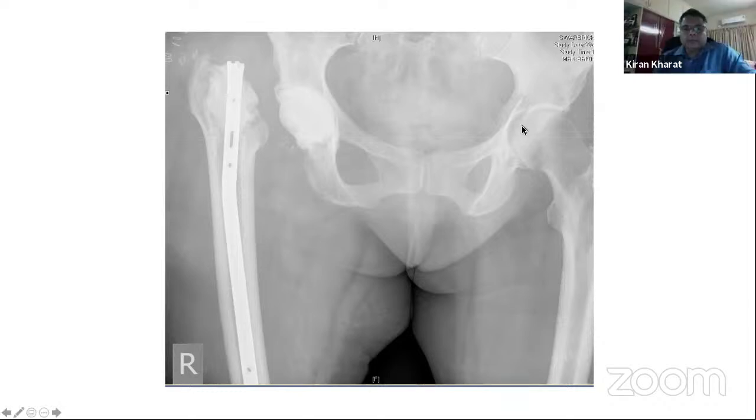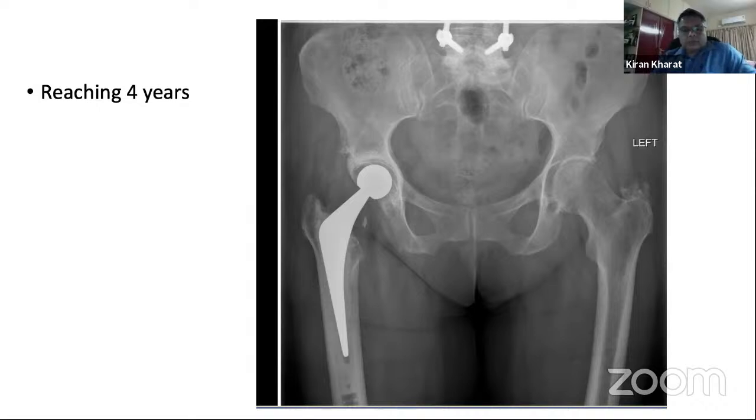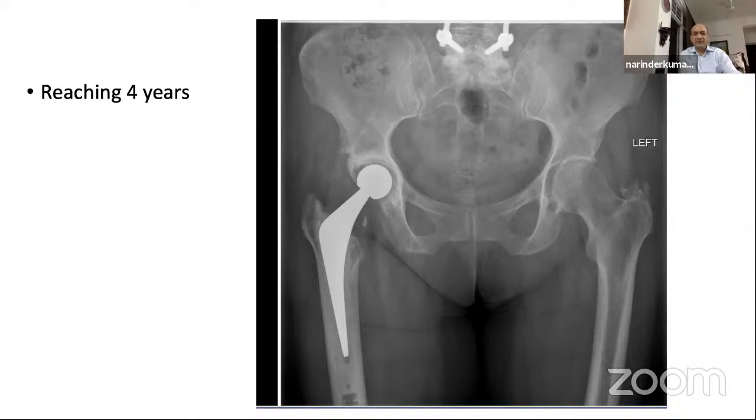Okay. So in this case, this was the second stage, and that is the 4-year follow-up. If I had shown you this X-ray as the first X-ray, I think the majority of you would have agreed that this looks like a slightly badly done primary hip replacement rather than a revision for an infection. Is that a fair comment? Well, yes. The proximal femur is quite badly deformed, so it would have been a really bad femur for a primary.